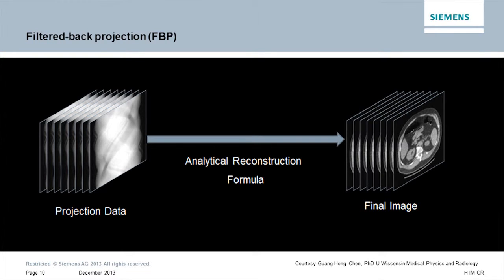And how can it be better? Well, because we're used to images based on a fairly crude method of reconstruction, which is filtered back projection. Why are we using a crude method? Well, because the method is a legacy from the days when our computers really weren't fast enough. Commodore 64s have a hard time reconstructing 150 512 squared images.